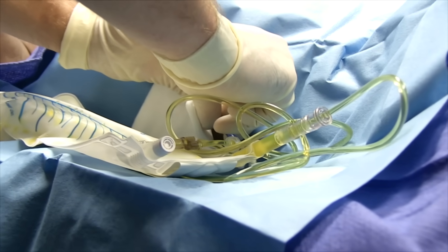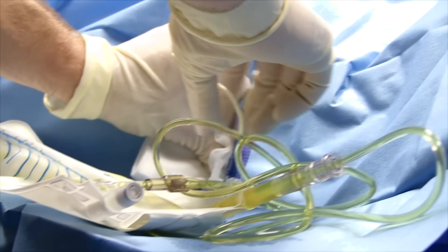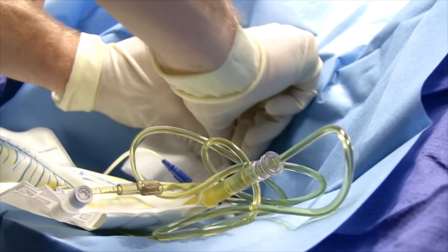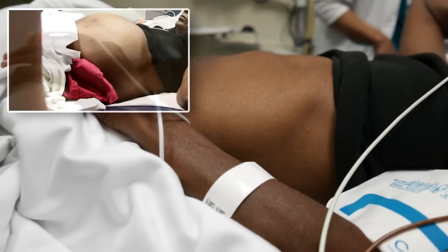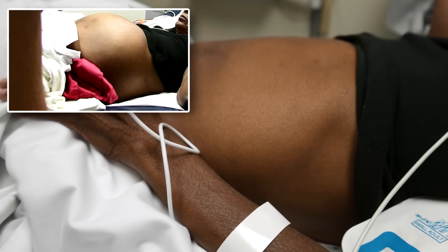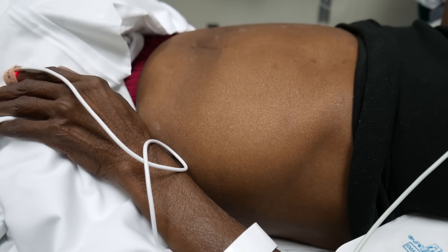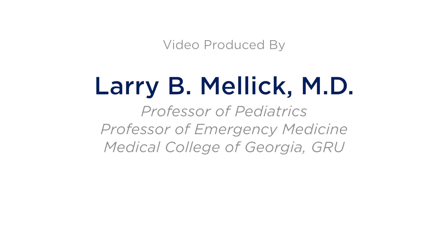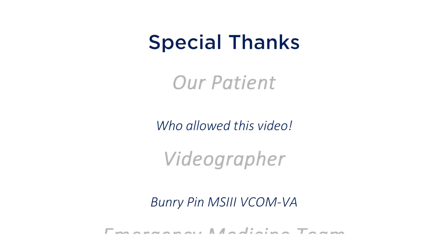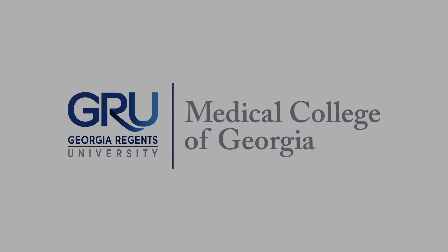Gently slip the thing out. You got a 4x4 ready? Go ahead and apply a bandaid over there.